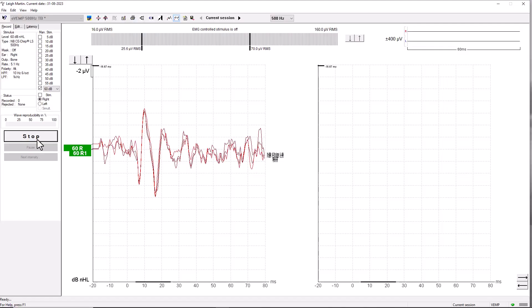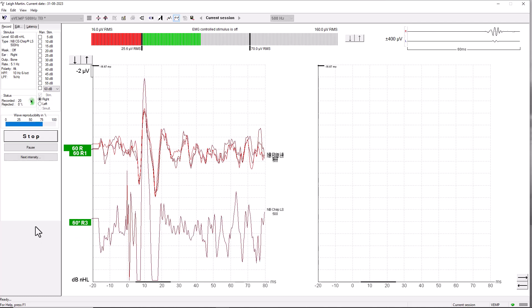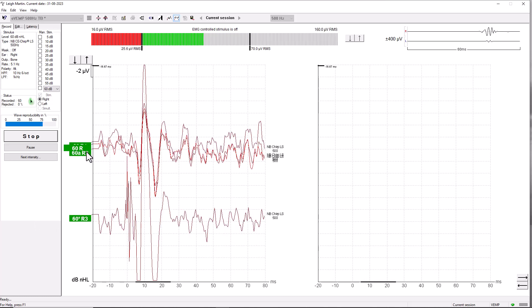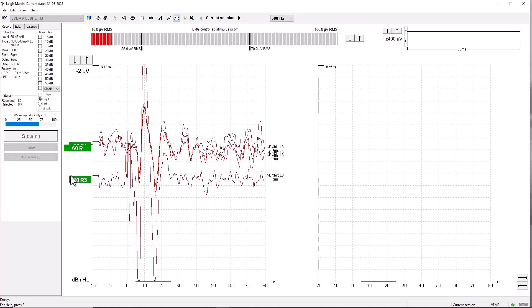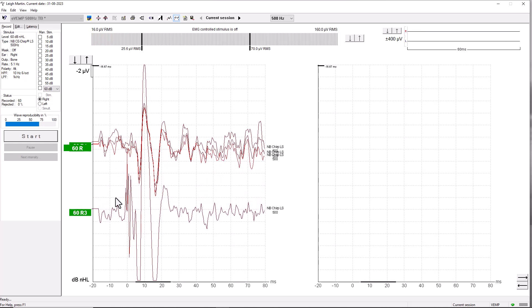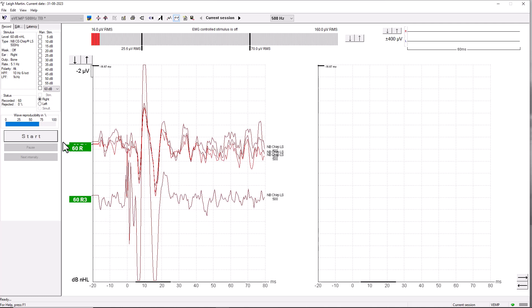Let me demonstrate this. This is how we had it earlier with the insert. I'm going to run another measurement with our patient assuming the gaze position, and collect that response with a short run — 20, 40, 60, 80 sweeps. What you can see quite clearly is the difference at the very beginning of the response: just prior to the N1 and P1 complex marked earlier, we can see a stimulus artefact — we can almost see the stimulus envelope prior to the response we're trying to capture.